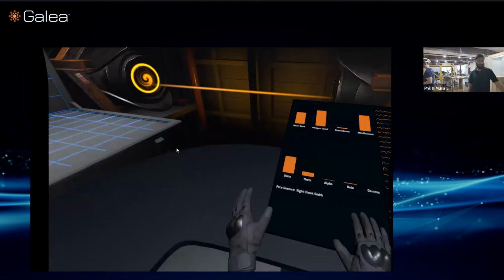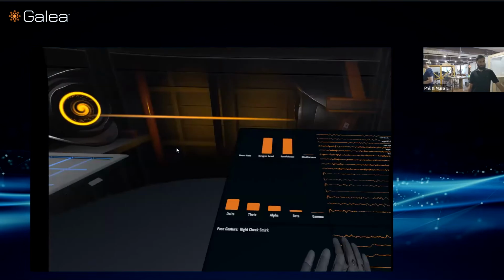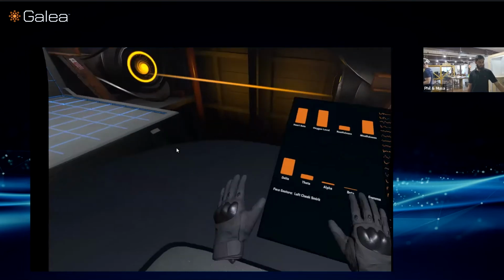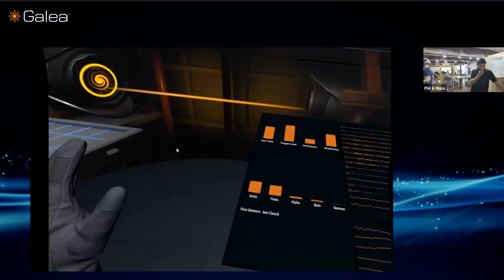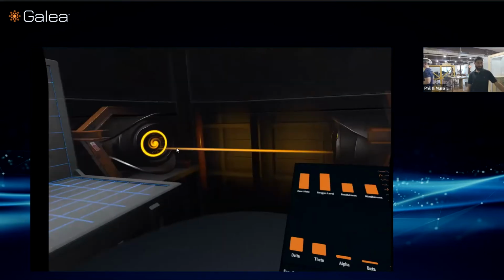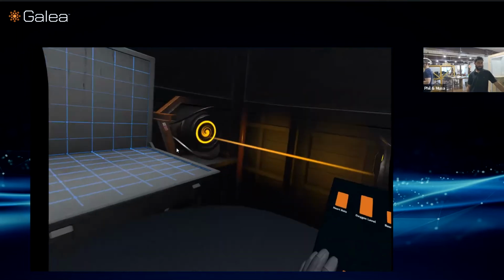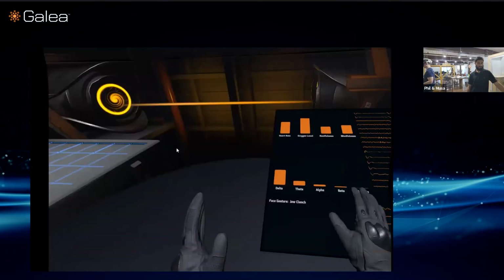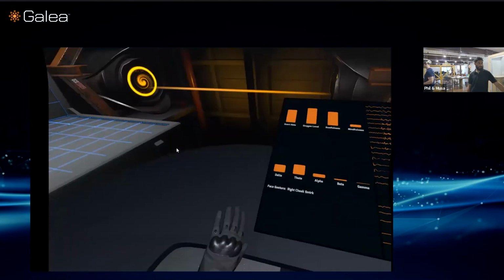Cool. So Musa talked a little before about the different band powers and what these things mean, but it can be confusing if you're not an EEG neuroscientist to go from delta, theta, alpha, beta, gamma to what restfulness or mindfulness is, what the brain is thinking. I think a good way to visualize this is an analogy of going to a closed football stadium. Say you're going to this closed football stadium and you've never heard of football before, you've never played football, you've never actually seen the game, you don't know the rules.